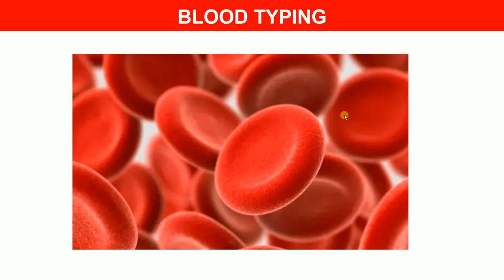Time for lab number 3 for our AP2. And today we're doing a couple different blood tests. We're going to start out by talking about blood typing and doing some blood typing experiments.